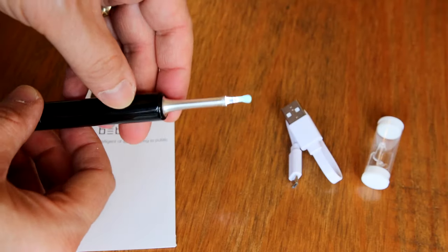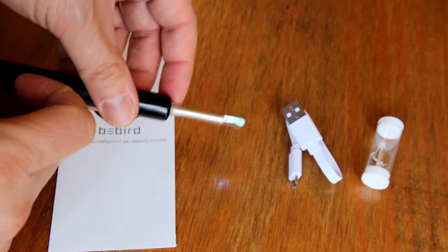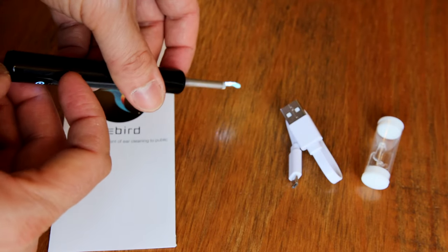I'll give you some close-ups as well so you can see this better. These are based on the same principle — they are Wi-Fi connected video cameras. The idea is that you put these into your ear and you can see around, and if you can see some wax, the little paddle at the end you can use to scrape it out. What I'm going to do in this video is review both of these and tell you the pros and cons of each.